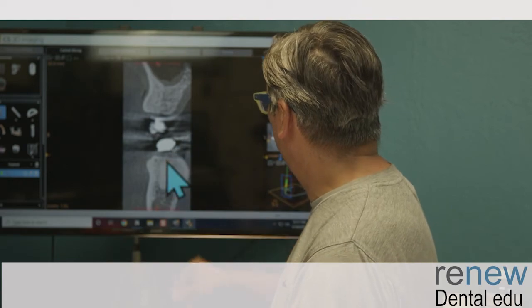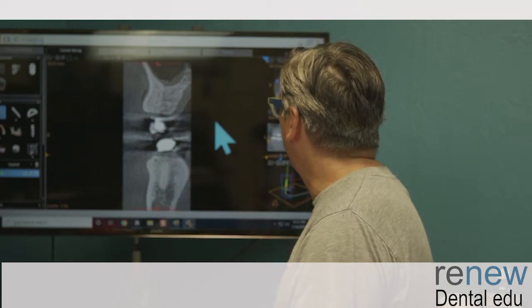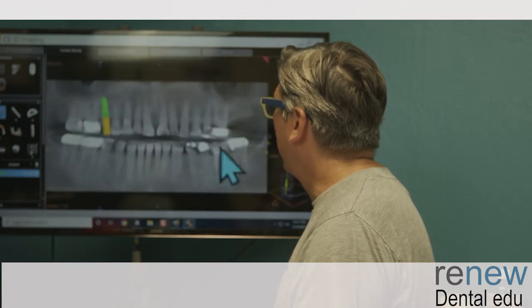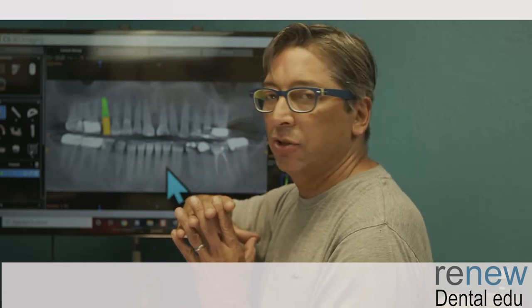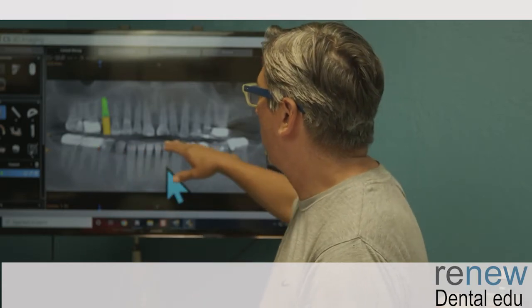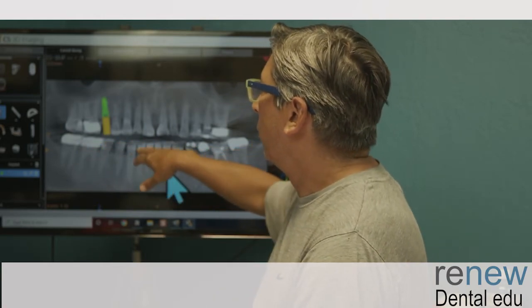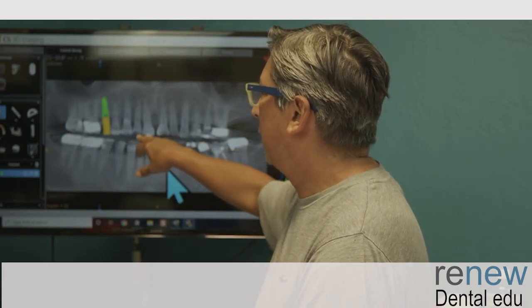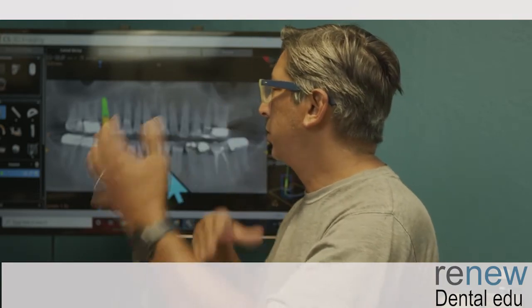Maybe even do a wider implant here, but that's not going to be the problem. This patient's going to have more problems with any other type of dentistry that you do, especially in the front. You're going to have to get a balanced occlusion, which he doesn't know where home is. His bite moves all around. It's all flat in occlusion. Once he starts wanting to fix these laterals or the centrals, you've got to raise the bite, etc.